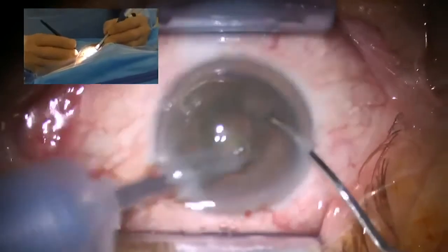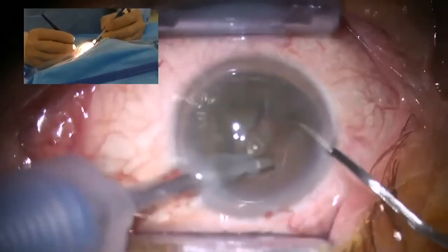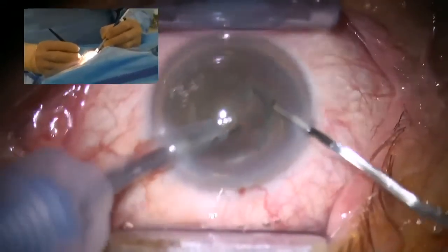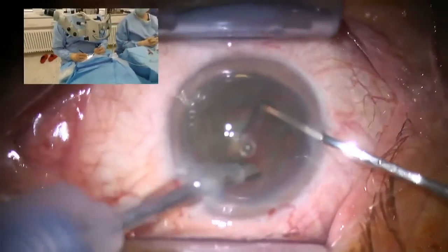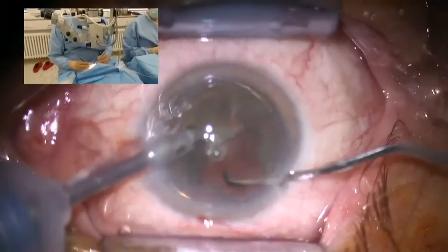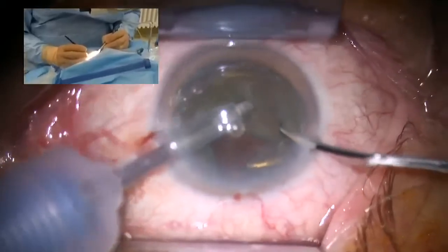So the use of the nanolaser is very self-explaining and very intuitive. You basically perform the surgery with the phaco machine you probably use, you are used to dealing with, but it triggers the laser.